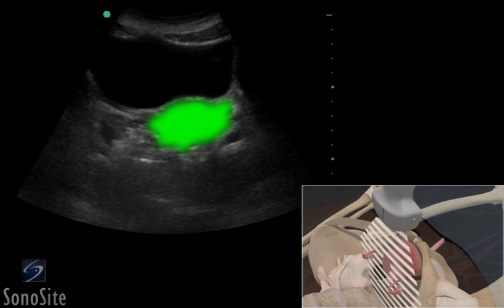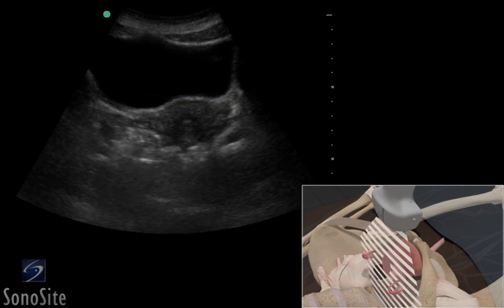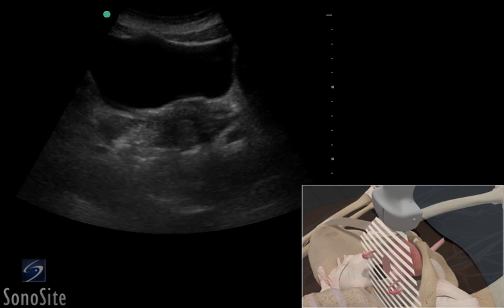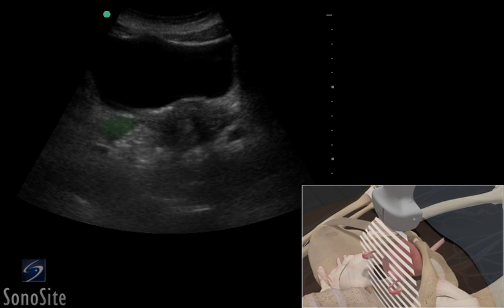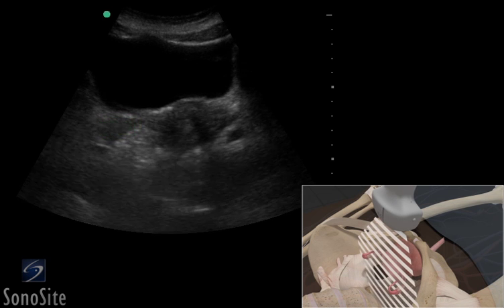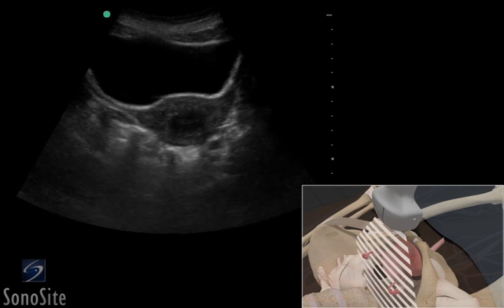The ovaries will be seen on either side of the uterus and can vary in location from a superior to inferior position.